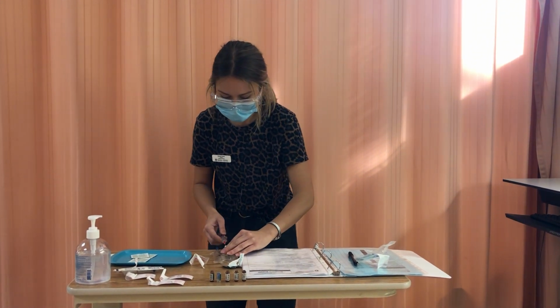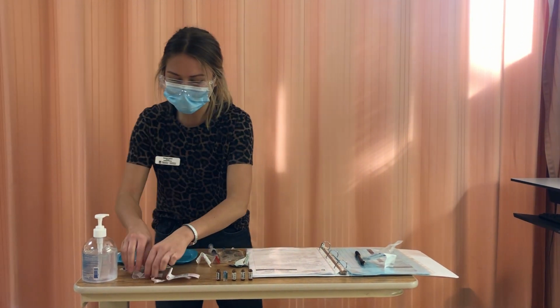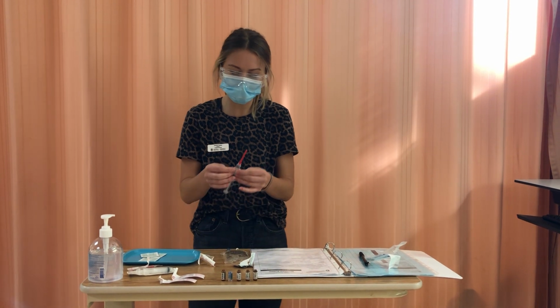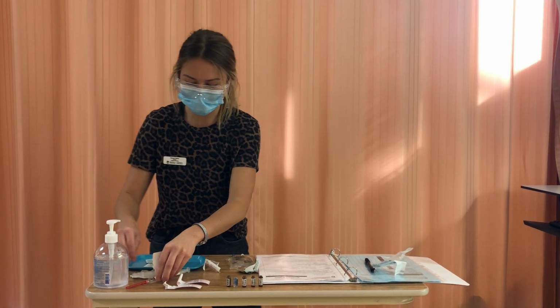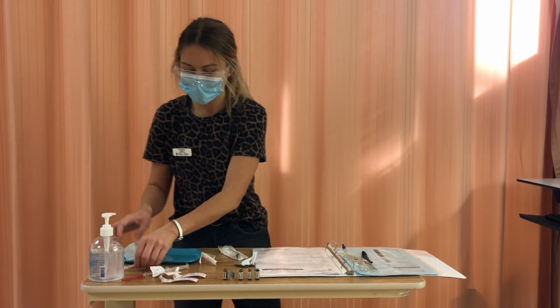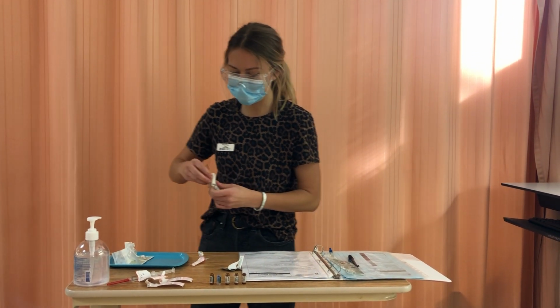Perfect. And I have my label to label it 5 mLs of normal saline, so that when my second nurse does their check, they know what this liquid is in here. So I have 5 mLs of normal saline here. I'm going to put that to the side, and then I'm also going to pull out. So there's 45 mLs of normal saline in this bag now. And I'm going to pull out and grab my morphine now.